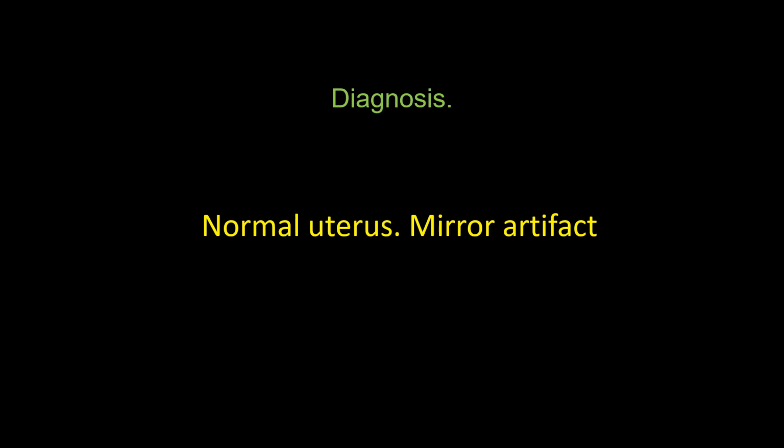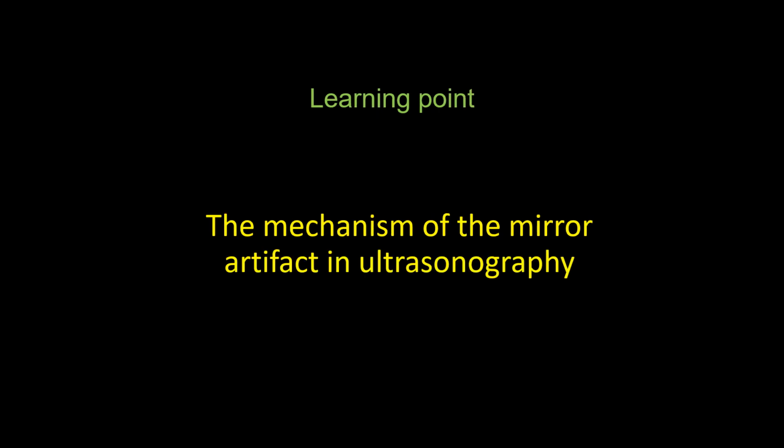The diagnosis here is normal uterus and is showing the mirror artifact in ultrasonography. And we have learned how this happens.